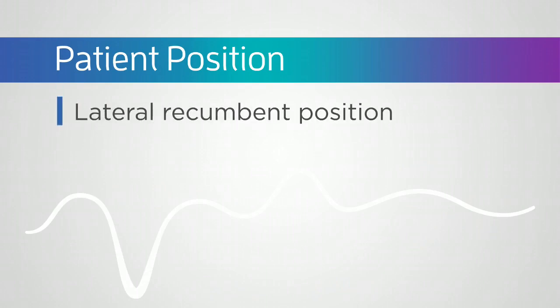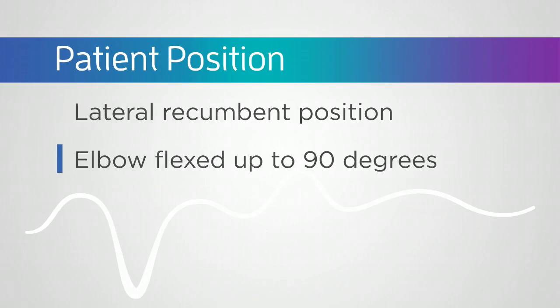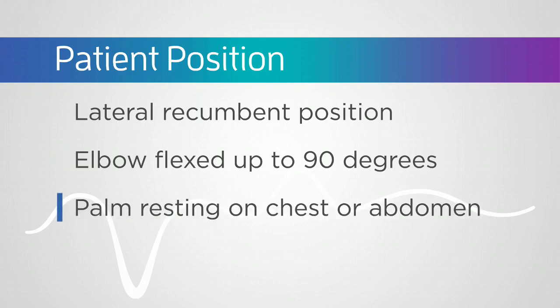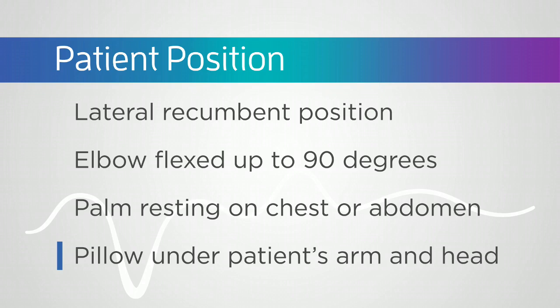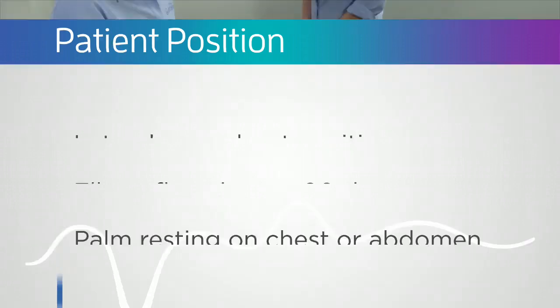Next, position the patient in a lateral recumbent position with the elbow flexed up to 90 degrees and the palm resting on the chest or abdomen. You can place a pillow under the patient's arm and head for comfort.